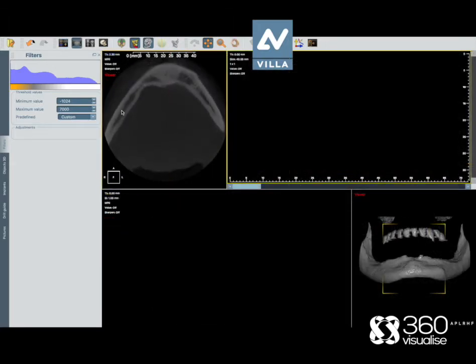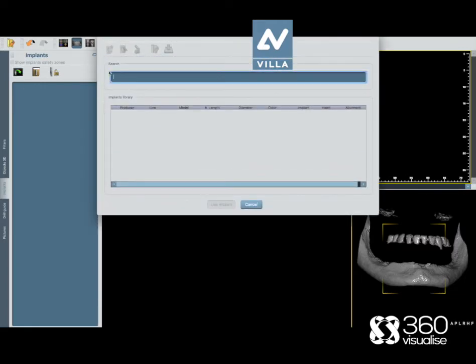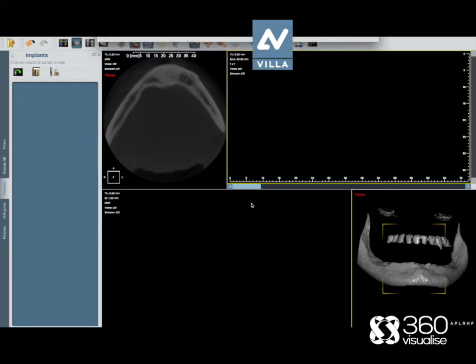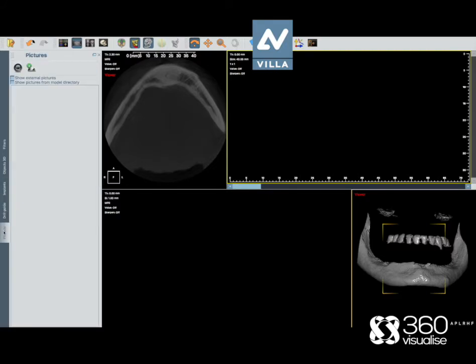You can create an OPG view here by tracing a line along the axial view. You can also place virtual implants, although the software itself doesn't come with an implant library — you'll have to get that yourself from your implant manufacturer. You can also produce drilling guides, although I haven't got any information on accuracy. I've spoken to Nimro and also to Ambridge Ceramics who make most of the drilling guides in the UK, and they haven't come across the software as yet.